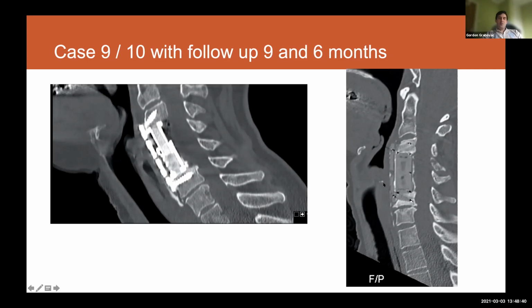I have been washing out those neck wounds because you want to prevent the clot, or you want to see beautiful instrumentation. I think the spillage of the content from inside may lead to the prevertebral bony formation. So it's quite metabolically, I think, a potent bone substitute.